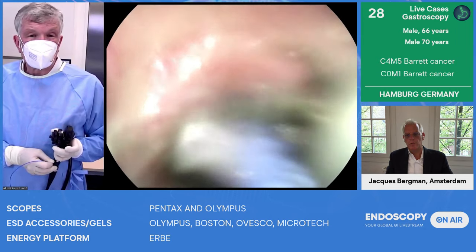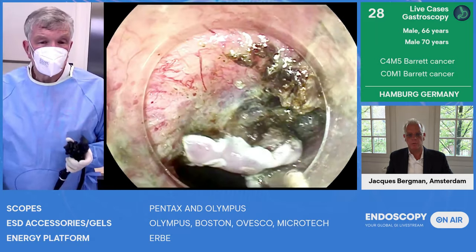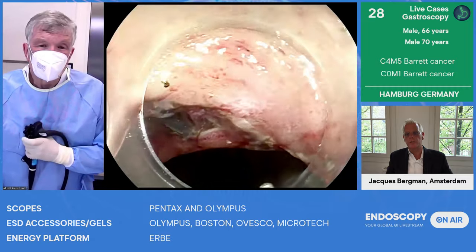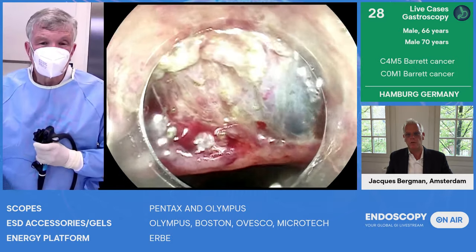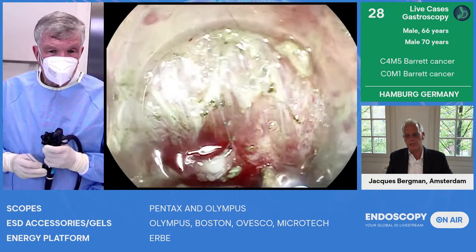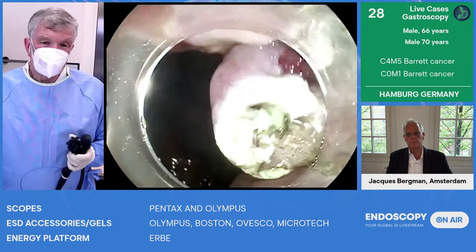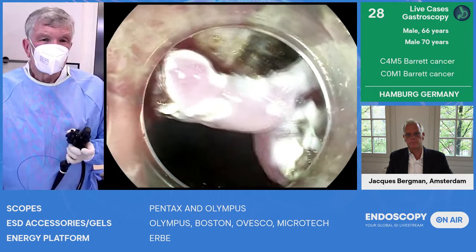So just for the audience at home, just to clarify, the lesion here is basically at the 12 o'clock position, and it's hanging down due to gravity. So that's why Thomas has the lesion pulling onto the submucosa, and that allows you to approach the lesion even at the 12 o'clock position. So gravity is helping during this dissection. And this is the anal side of the incision. Yes, so I can show, I'm almost around. Here's the lesion. I dissected the lesion around here. And then we will go on.